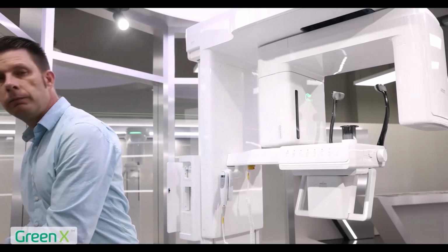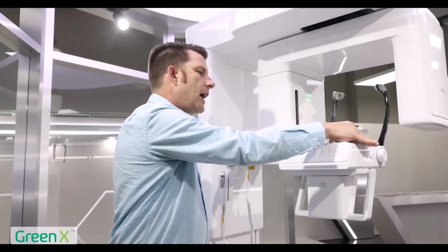We're going to go ahead and grab a dry cloth and then dry that area off.